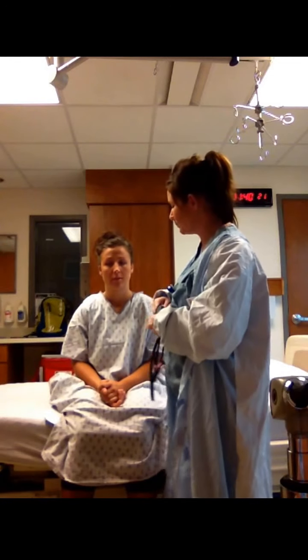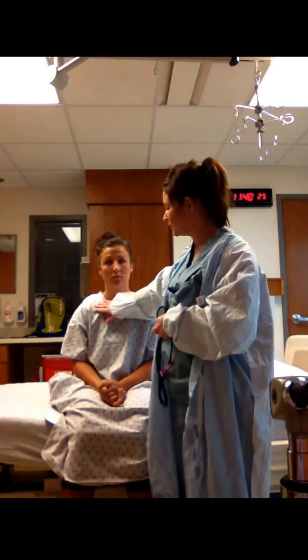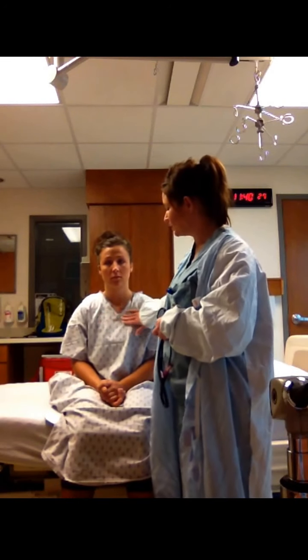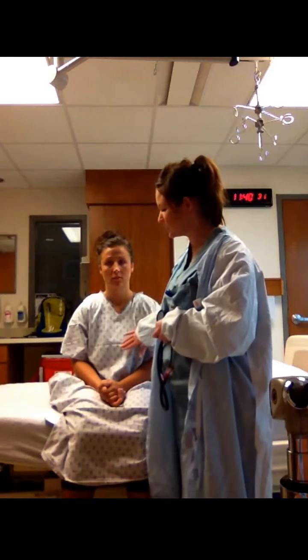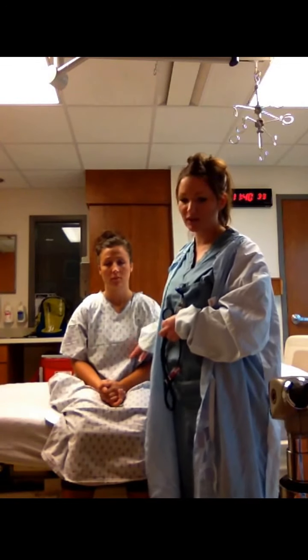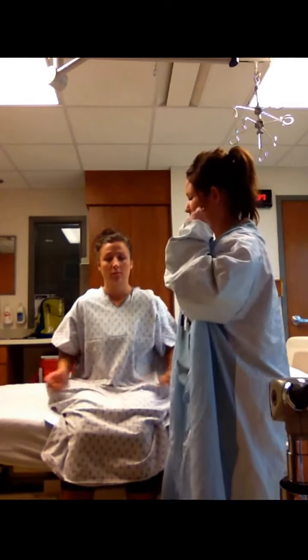First landmark I'm going to be auscultating will be the outer third of the clavicle, and then I will move down to the second intercostal space, third intercostal space, fourth intercostal space, and fifth intercostal space right under the breast tissue. Courtney, every time I lay my stethoscope down, I want you to take a breath in for me, okay?